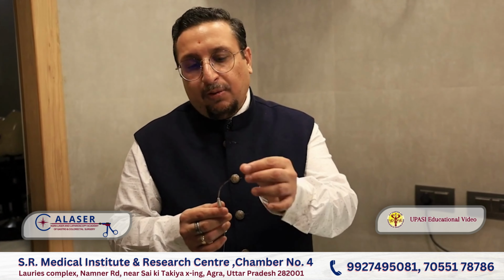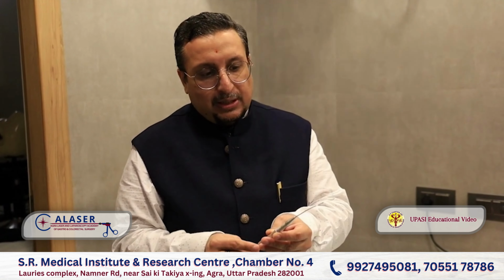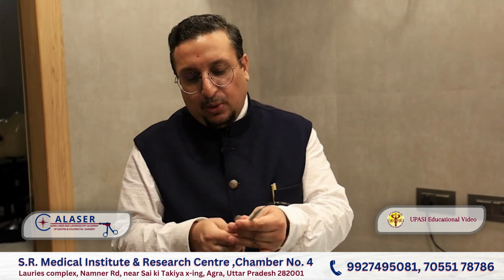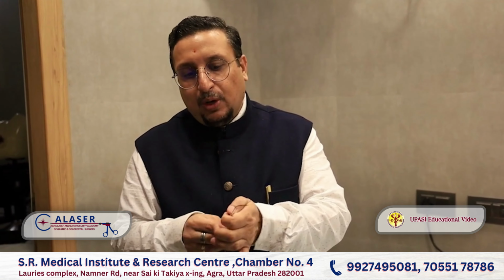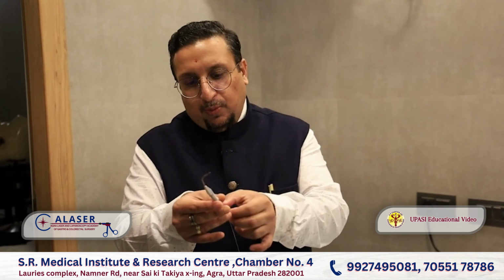And second thing, you don't have to move the fiber against resistance. You have to move it very freely. If you move against resistance, the chances of breaking are there, and you should keep 1 to 2 millimeter outside. Understood this point? So you have to insert it, keep 1 to 2 millimeter outside, and then make it taut. It should be very tight. It should not move, because when you are working, according to heat, it could move slightly down. So it should be very tight, right?